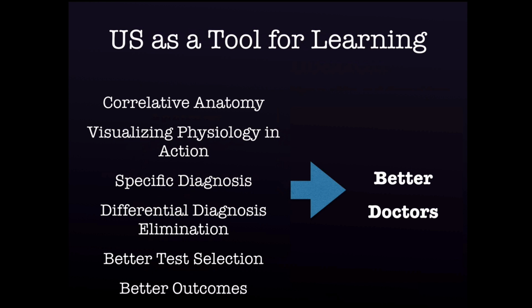So we're using ultrasound to help you correlate anatomy, help you visualize physiology in action, work to specific diagnosis, differential diagnosis elimination, help you make better test selection, help you have better outcomes, and that's what makes you a better doctor. And I know that takes a little bit of faith on your part, but as you go through this year-long rotation, you'll see that you're going to get better ultrasound skills, and when you examine a patient, you're going to be reaching for the ultrasound, because you're like, well, if I can tell if their bladder's full, I don't need to stick a Foley in them to see that they have urinary retention. I can just see it, and I know my answer immediately, and I didn't go through a nurse.